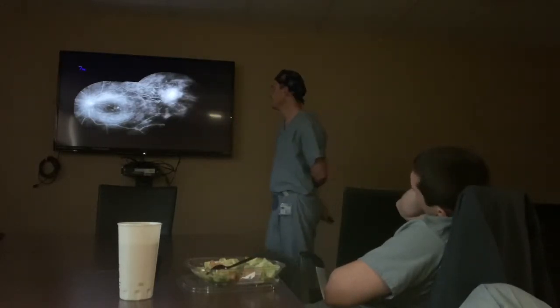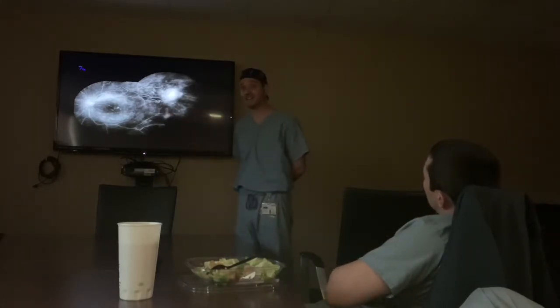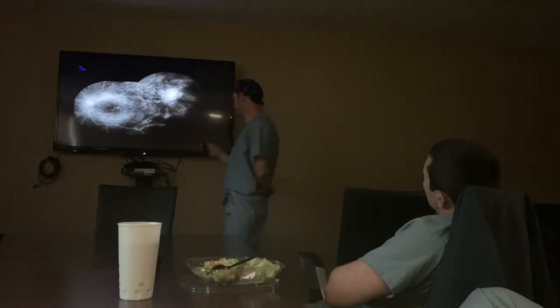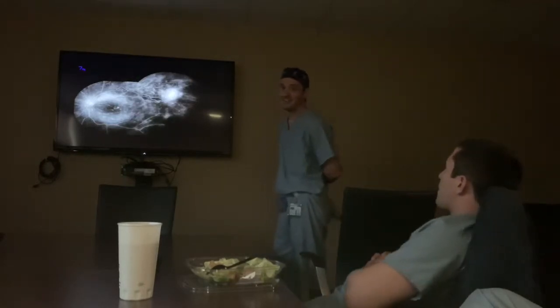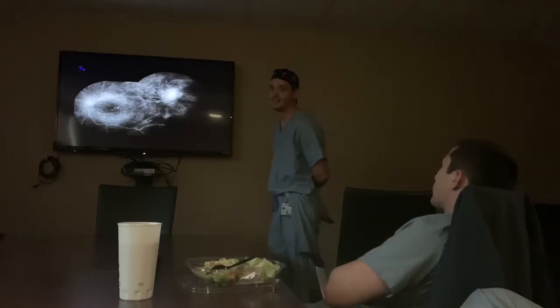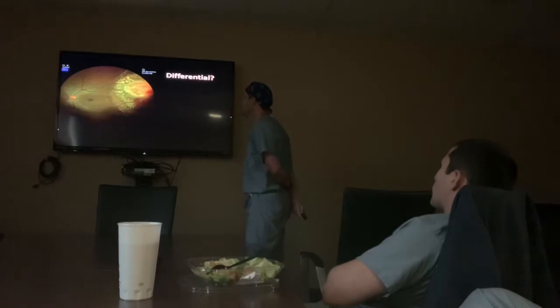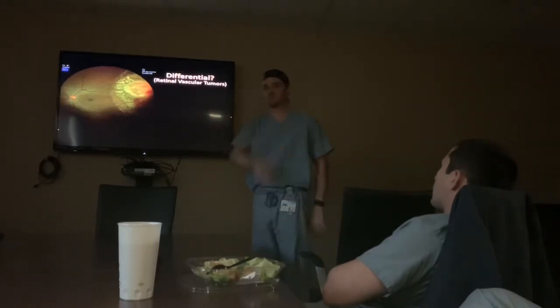The patient actually came in as a uveitis referral. You can see where someone would say that, but it's all one entity. In macular edema cases the retina tends to light up when the eye is not happy. So let's go to the differential.